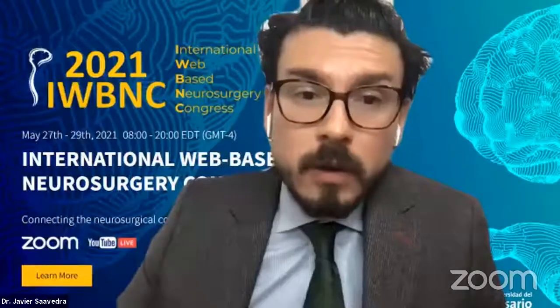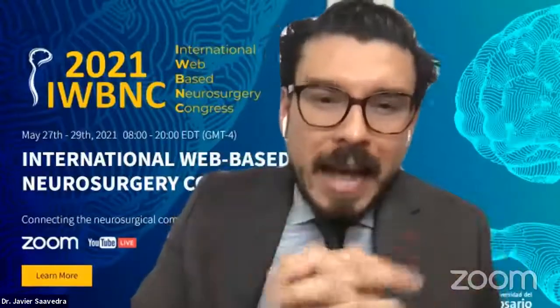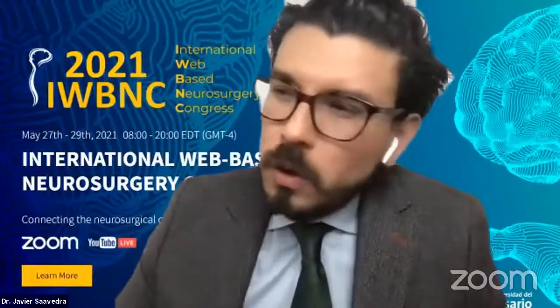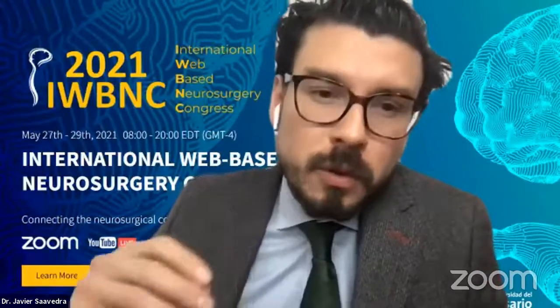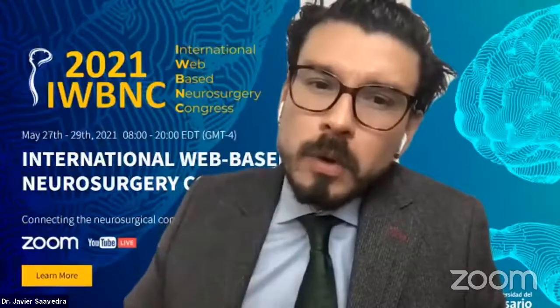Dr. Benavides is asking, how feasible is it to perform a gross total resection of the lesion through the TONES? It is very possible. I've seen the images. It's very possible. I think it's a more direct and shorter way. So you really find it very easy to handle tools in this approach. It's different if you're used to using endonasal ports.